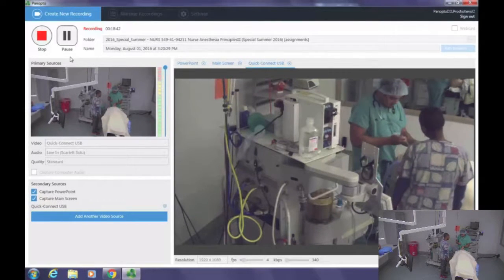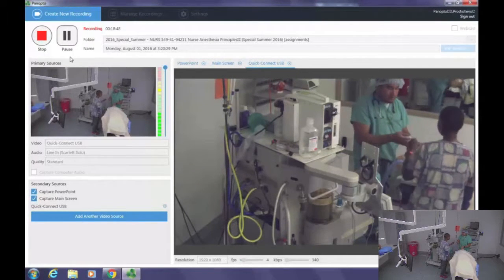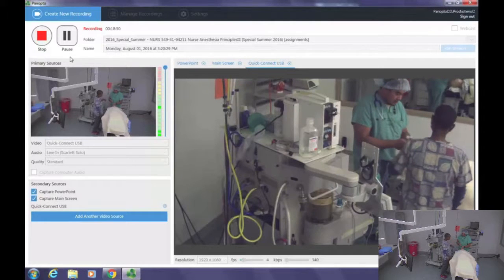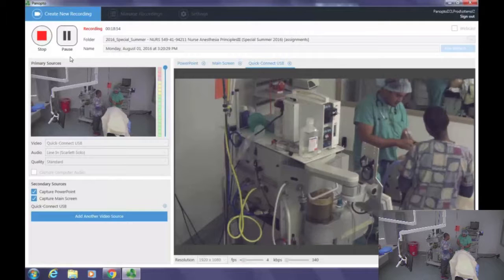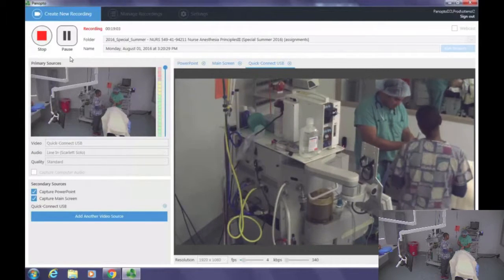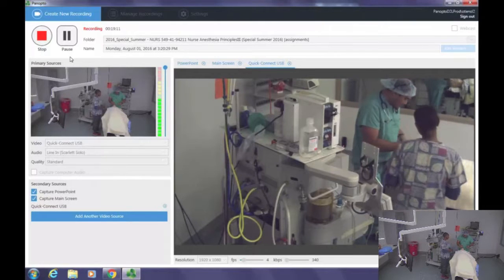So, tip up. If you visualize the vocal cords, go ahead, and once there, you could remove the stylet. And then you could advance it. Once you advance it, you could turn it 90 degrees. Don't remove your Mac blade yet. You have to visualize that you turned it. So I think we got a good position, and then slowly I'm going to remove this.